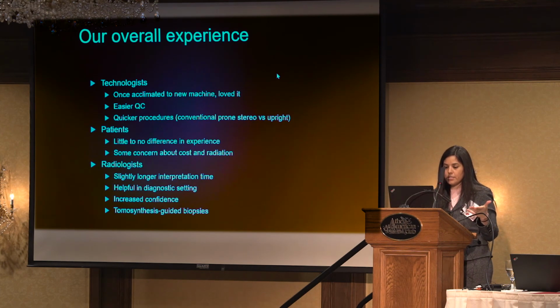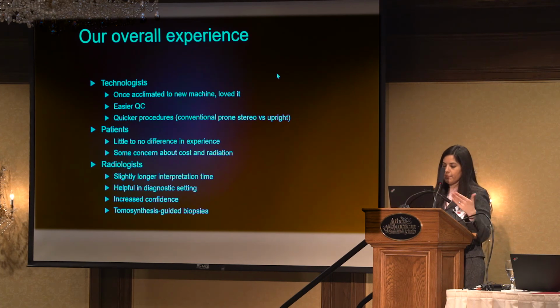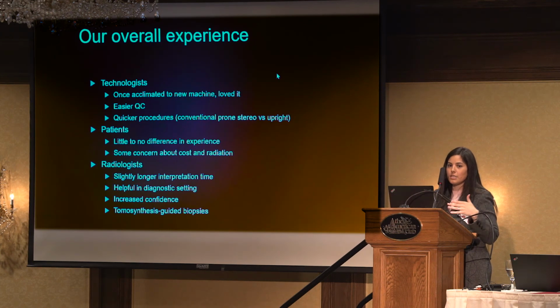And our radiologists struggled with longer interpretation times, but quickly adapted and saw the benefits, especially in the diagnostic and screening settings. There are many days that go by that a patient has a 2D mammogram and I say to myself, oh, I wish we had a tomo. I wish this patient let us do a tomo because I would know what this is. And tomosynthesis guided biopsies have actually really expedited our biopsy procedure and cut it about in half.